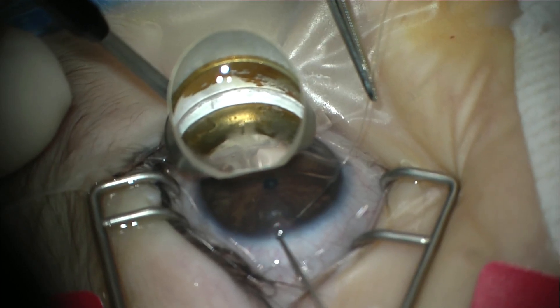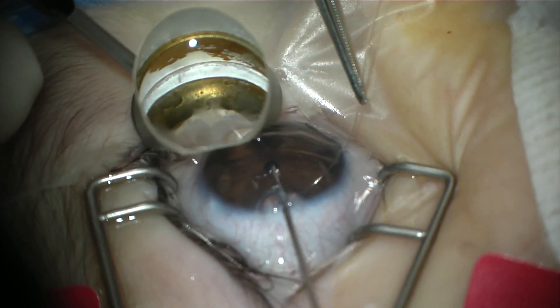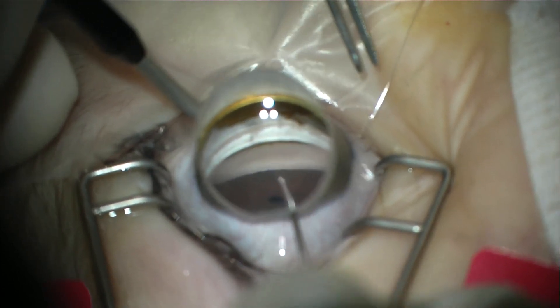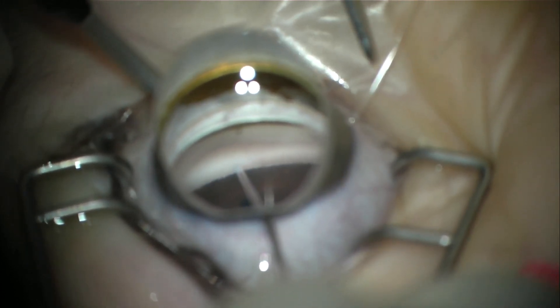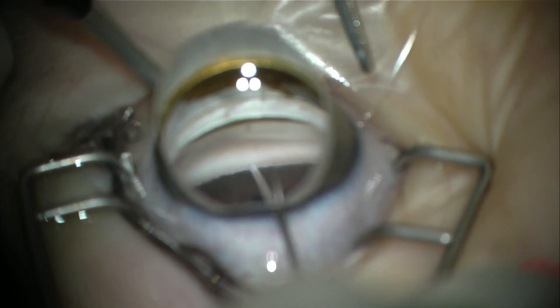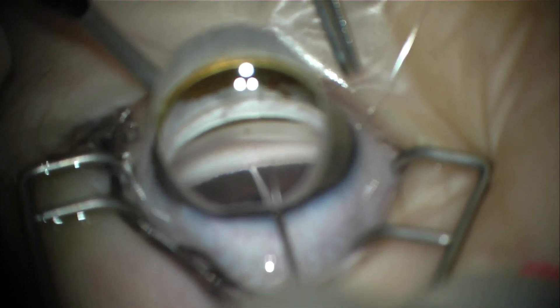The microcatheter has been inserted through the peripheral clerocorneal incision and now we'll use a goniotomy needle with the gonio lens to make a small incision in the trabecular meshwork on the opposite side of the anterior chamber. This small incision will give us access to Schlem's canal for the catheter insertion.